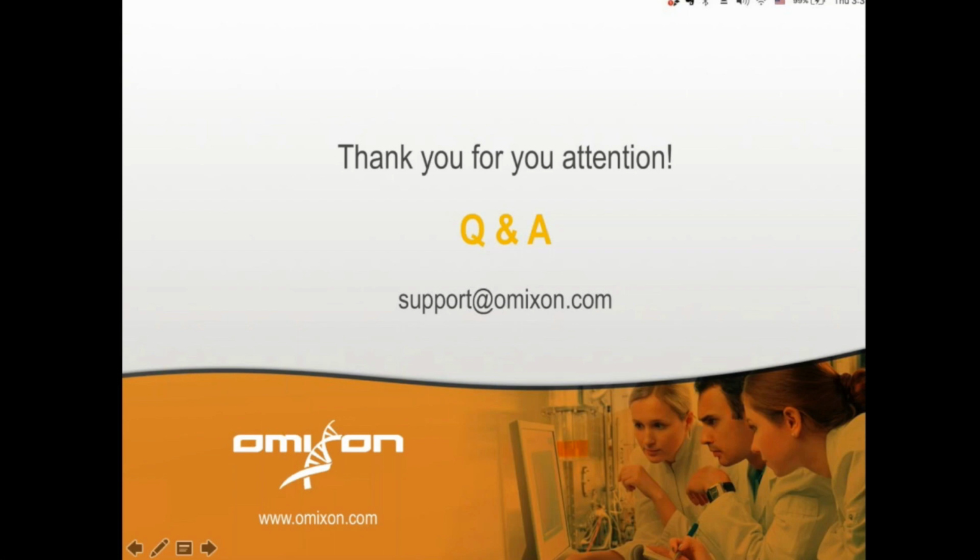So that's it. And it will significantly reduce the time that you spend for the PCR preparation, and also it will reduce the risk of user error.